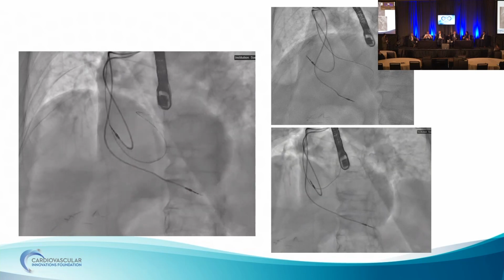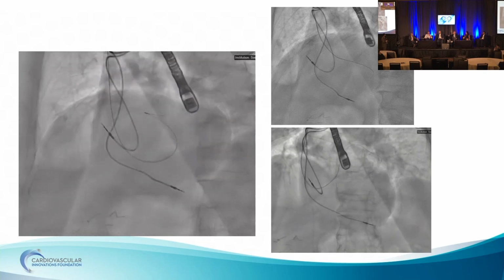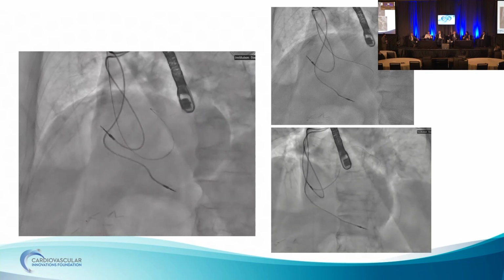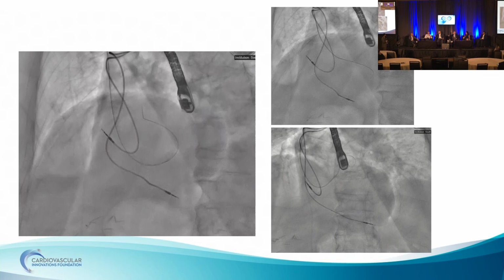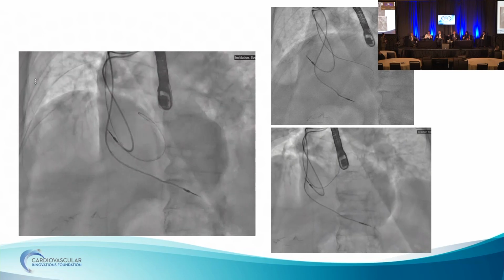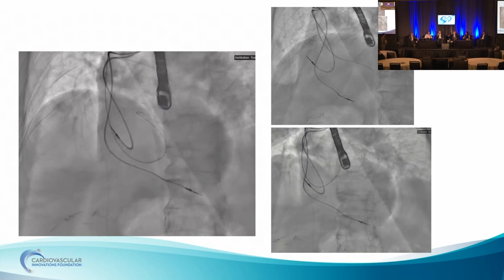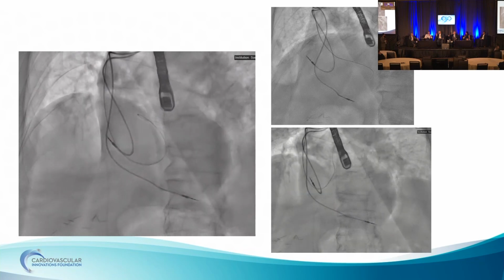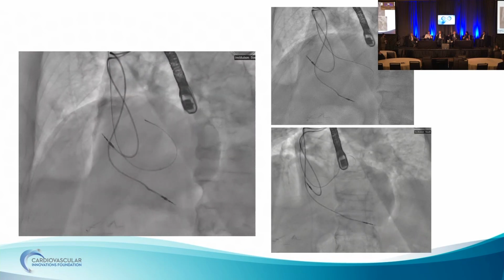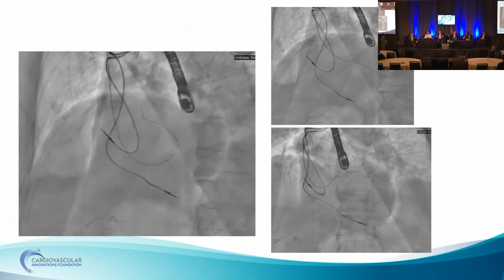But usually these are 4 millimeters wide, but they're 12 or 15 millimeters in the other axis, right? You didn't show anything about IVC waveforms and stuff, but if they're really stenotic, where you wouldn't get thrombus to them, people tend to have engorgement of the lower extremities, etc. So presuming that there wasn't clinical symptomatology, it is probably a half-moon or quarter-moon kind of looking IVC, where it just makes catheter manipulation challenging. And sometimes they'll even open up with stiffer wires. If you get across it and put a stiffer wire, it's such malleable stuff that they'll just kind of open.